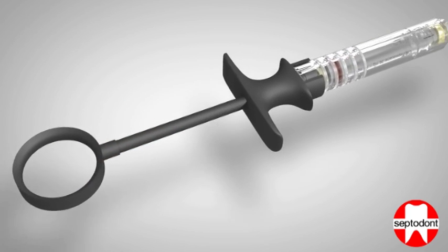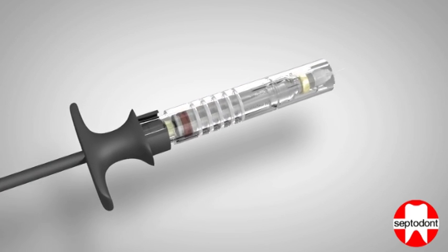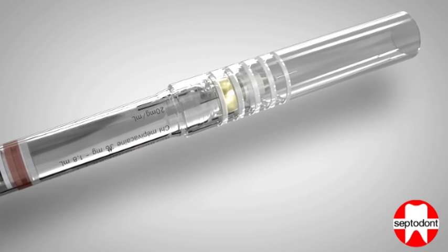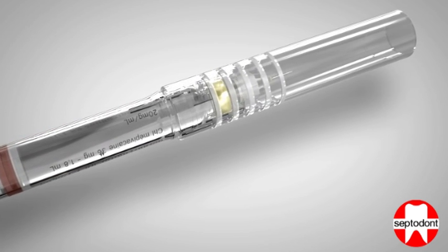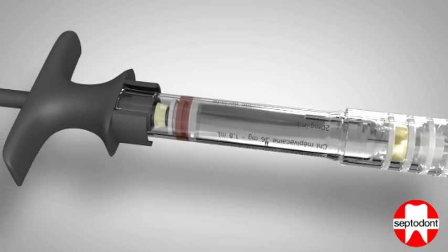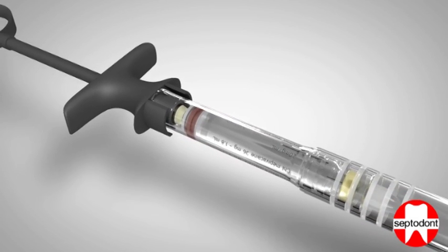If at any time during the injection procedure the device needs to be placed on the bracket table, the needle can be protected by sliding the protective sheath gently forwards until resistance is felt. At this point, gently ease the sleeve further forward into the holding position.